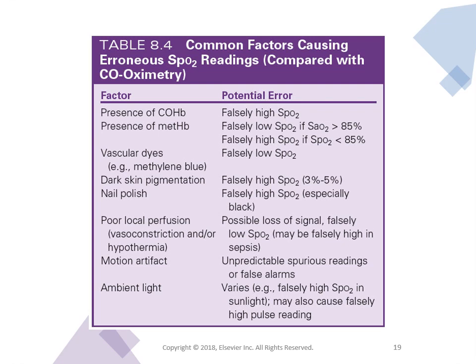Table 8.4 displays common factors causing erroneous SpO2 readings as compared with co-oximetry. Please review this. It's on page 149 in your book.